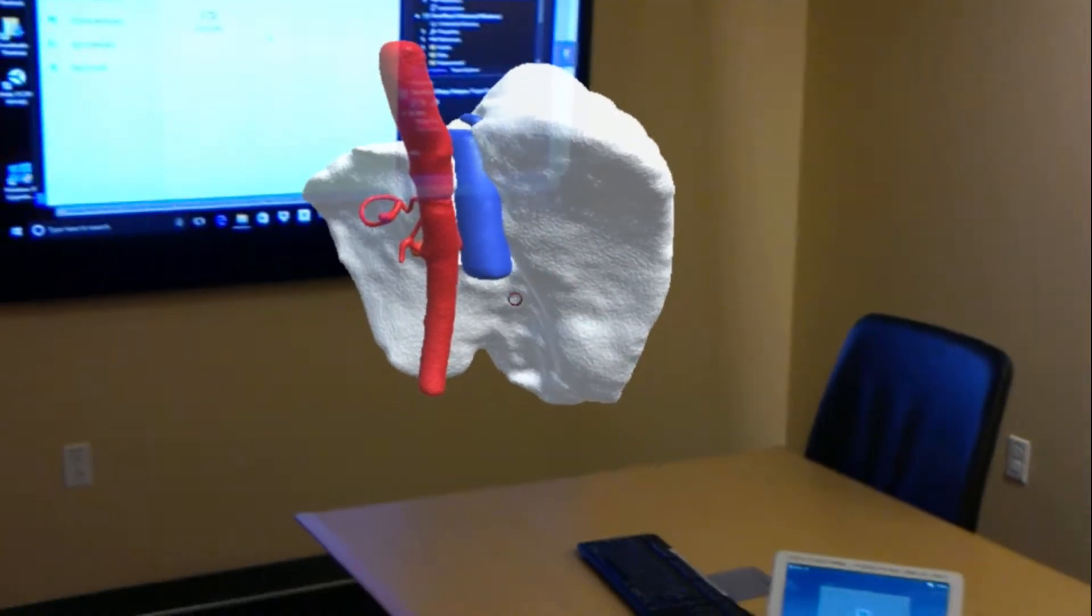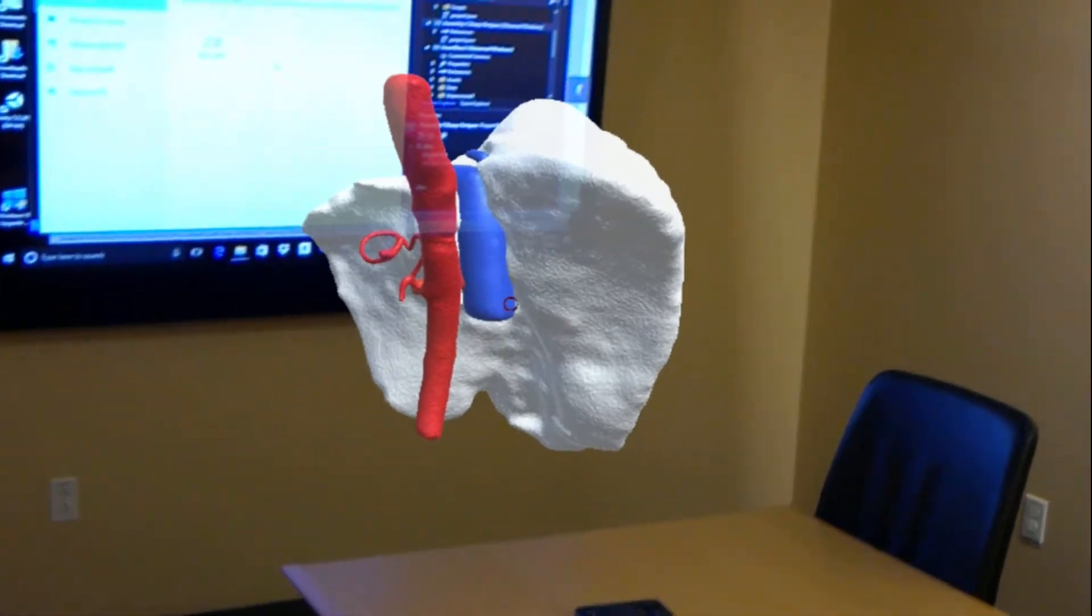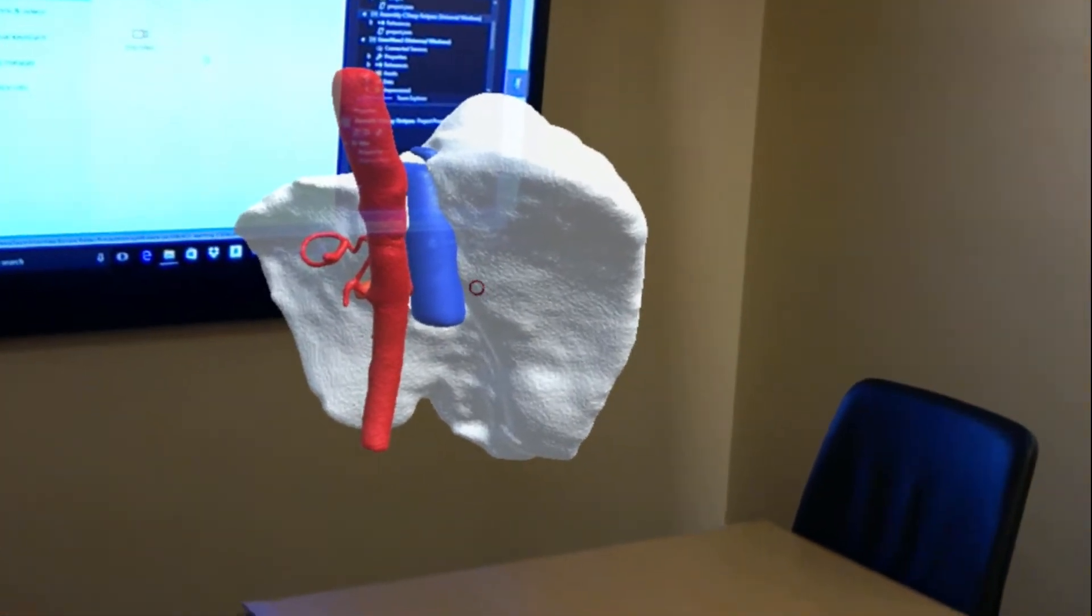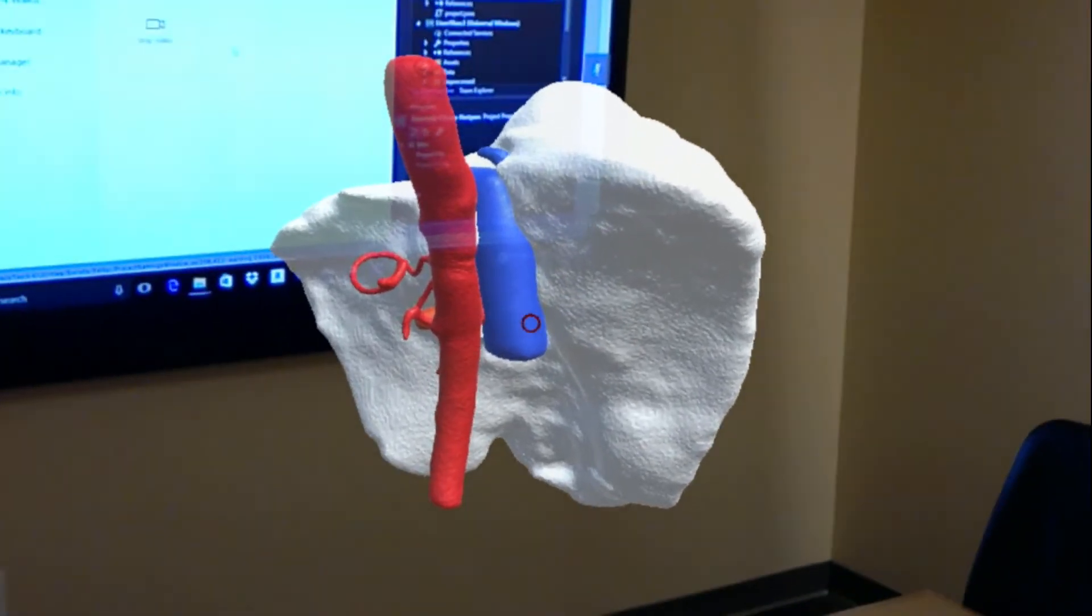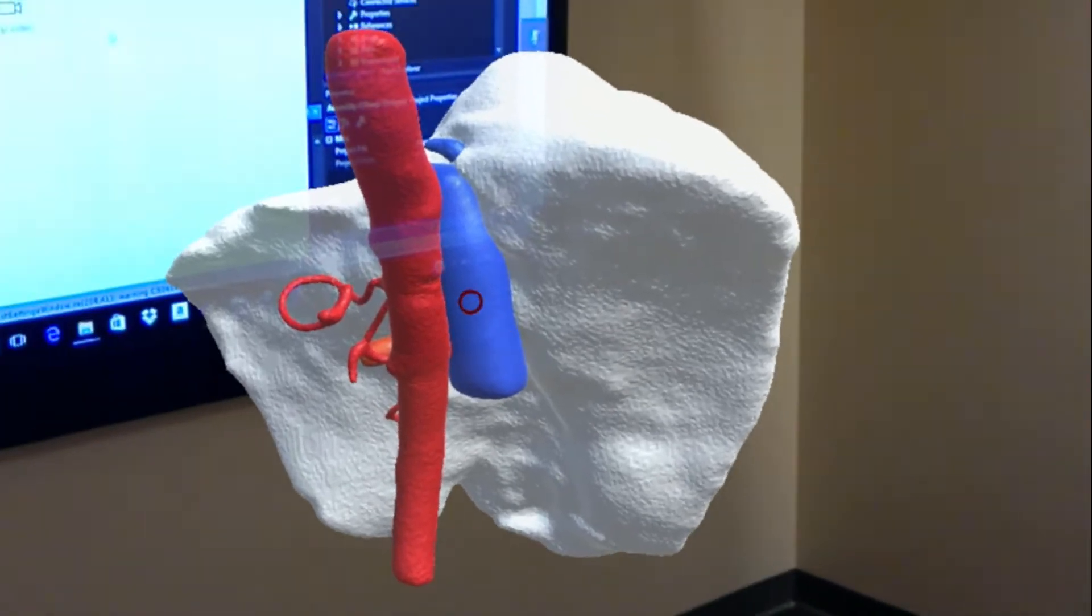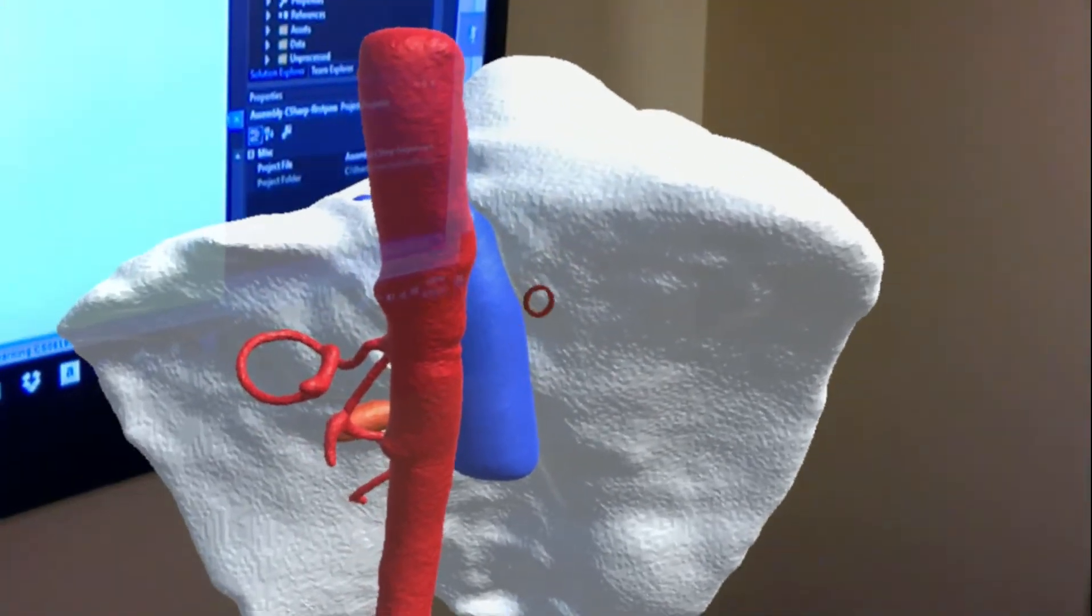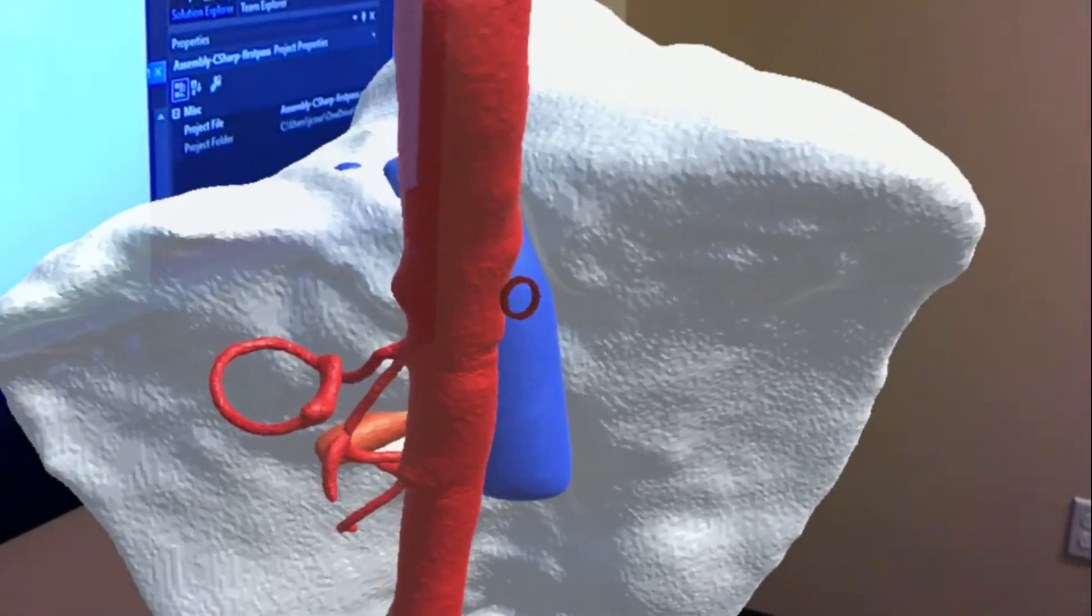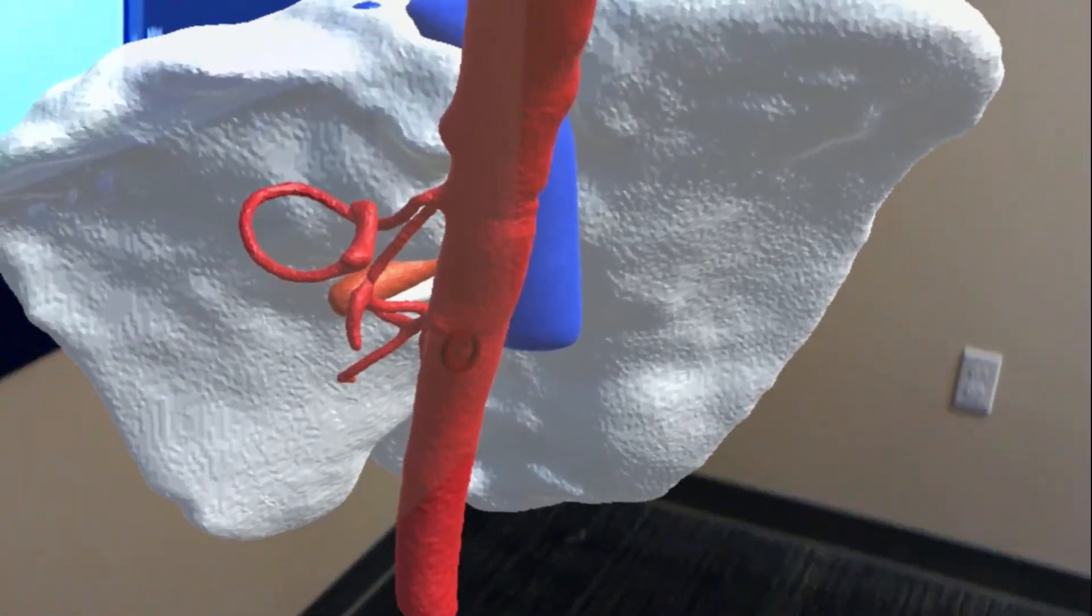Here is a hologram derived from a CT. This is a CT of a patient with a liver mass. This file is being displayed on HoloLens via HoloSurge 3D.